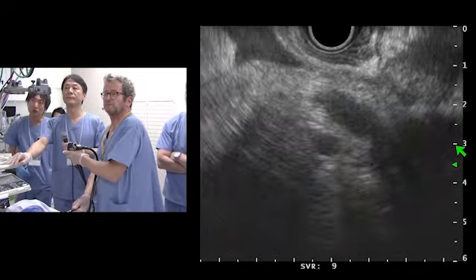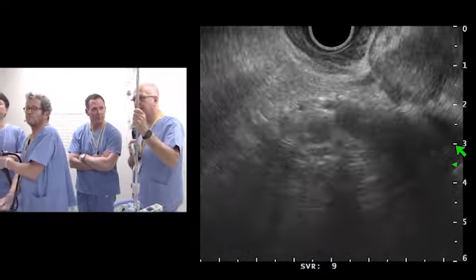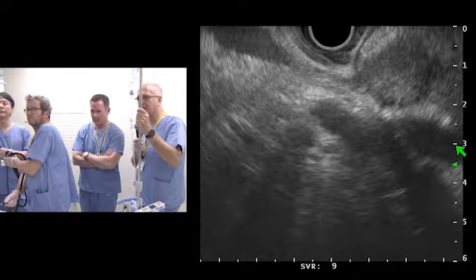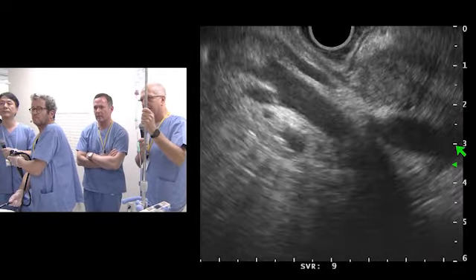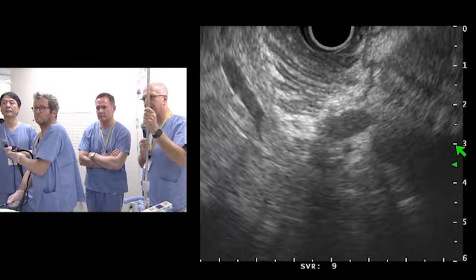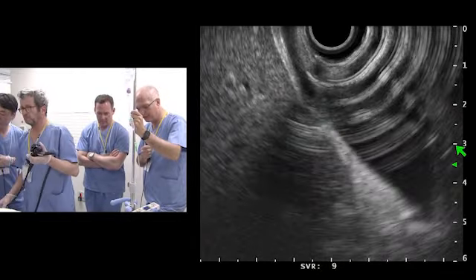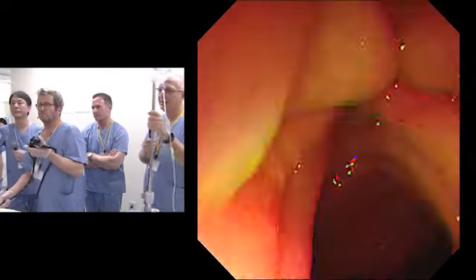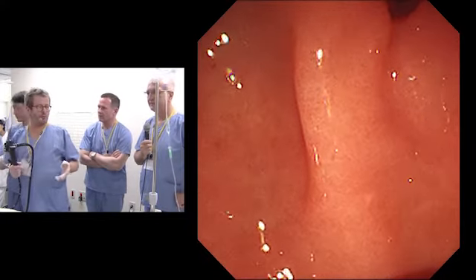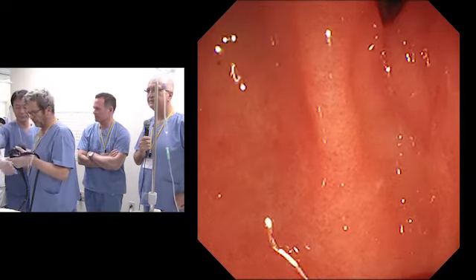You're right. Well, we have to keep in mind that even for resectable patients, there are more and more MDTs which decide to send the patient for neoadjuvant therapy in many cases. So I agree that this patient could go directly to surgery, but you see that there are several suspicious lymph nodes there. I need to reposition. And in many cancer centers, they really like to have an FNA or a histological confirmation before. I will insert now. So what do you think? Should we perform FNB, or leave it like this? I would do an FNA for me. FNA or FNB? FNA.